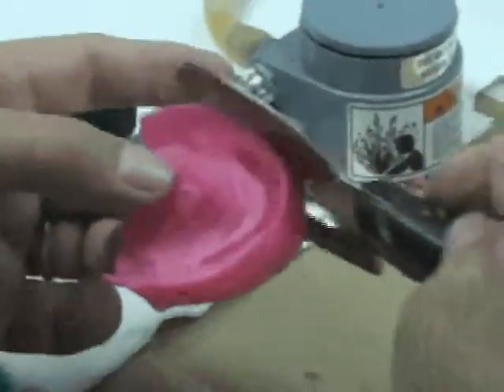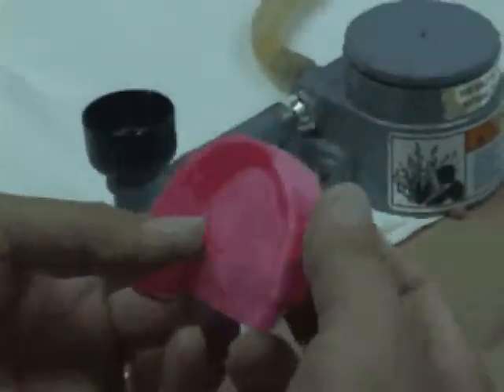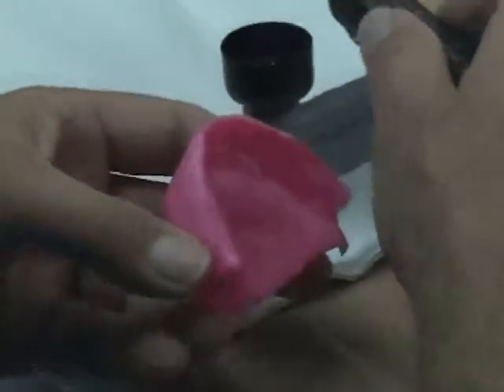This patient is a class 2 division 1, so his ridge in the front is relatively narrow and rounded, and you just follow the arch form, which tells you exactly where his teeth were at one time.